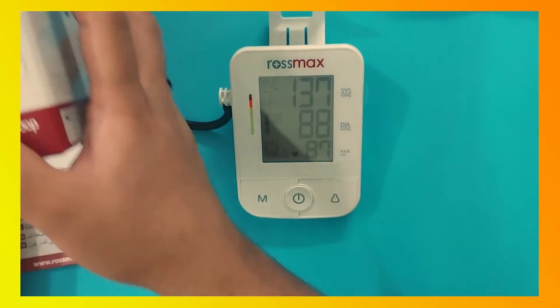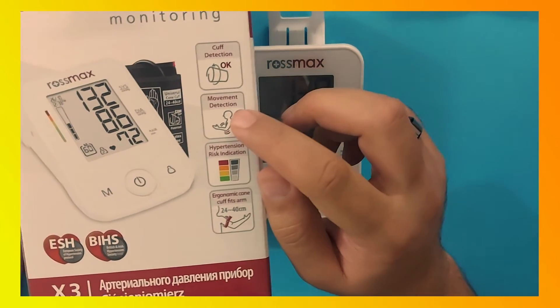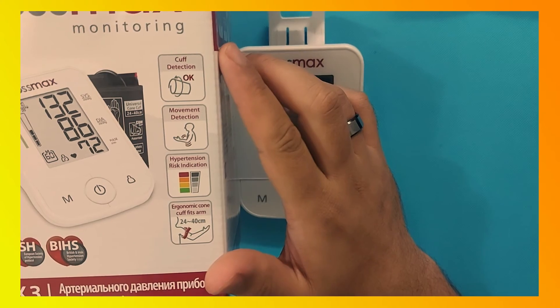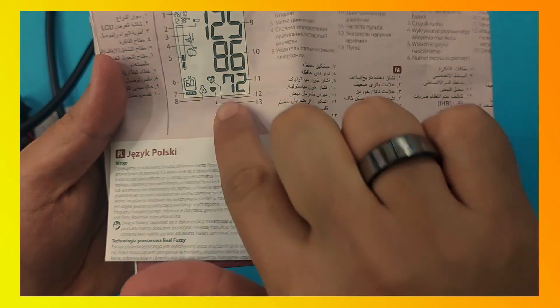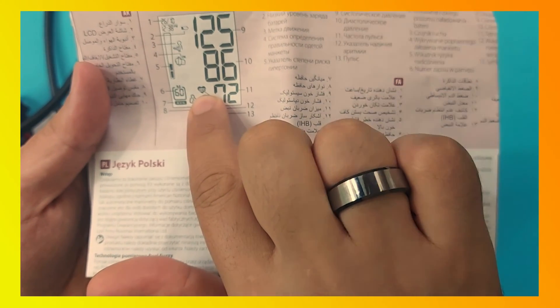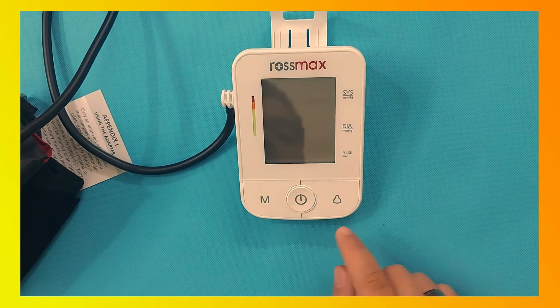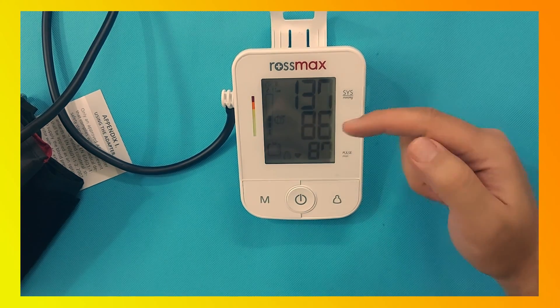The motion detection gives you a sign if you are moving or shaking your hand during the BP measurement. The irregular heartbeat is indicated by a heart symbol. If you want to check a previous reading, press the M button — this is for memory — and the device will show you the previous readings.